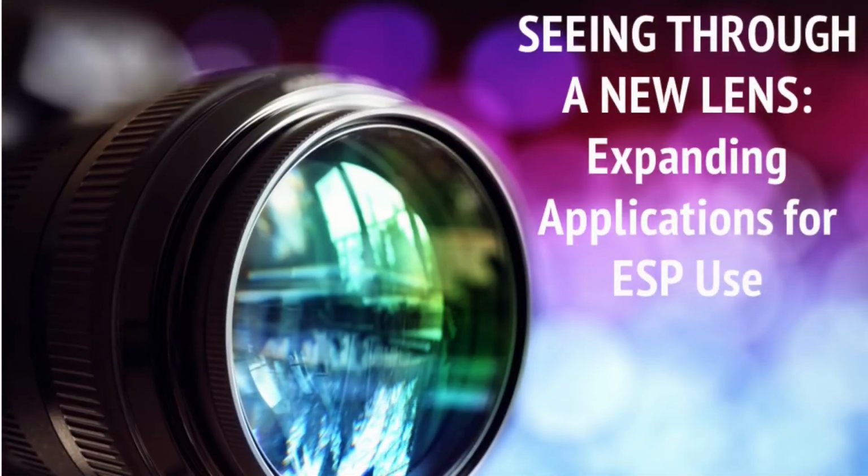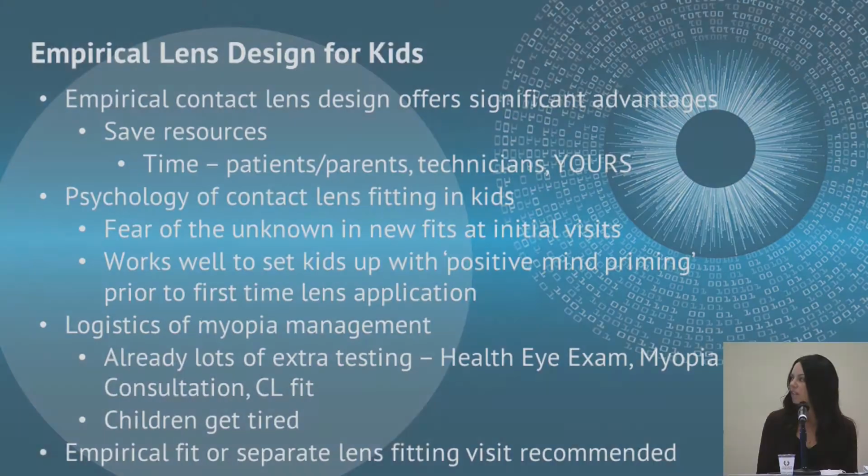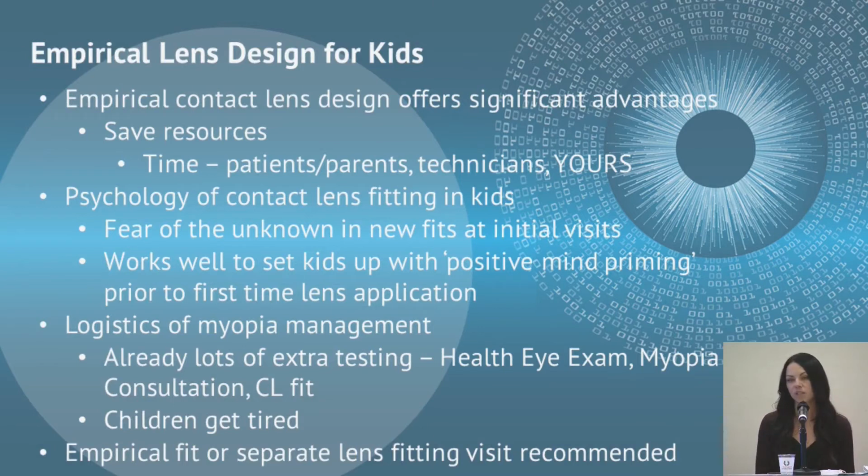Not only is our scleral data very accurate, the cornea data has really come a long ways to the point where we can now utilize ESP for other applications, not just fitting sclerals. And one thing that I've noticed that's a huge benefit that now the ESP is able to provide for us is that whole empirical design flow.